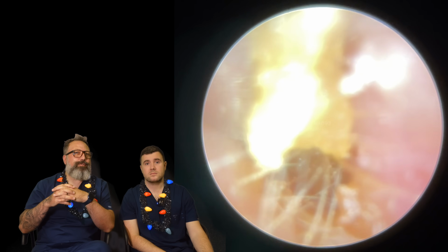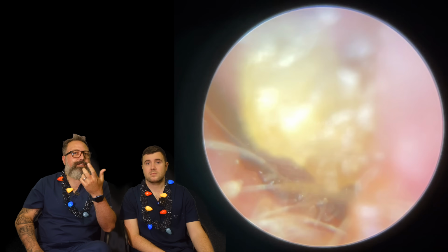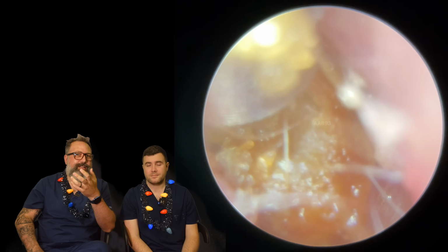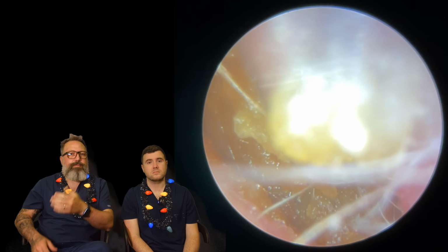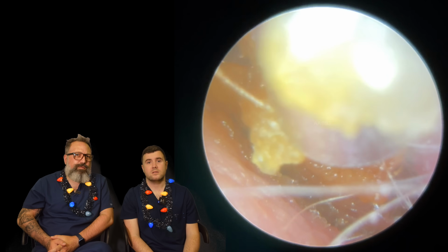So there's no wax. Now, lots of people ask, one of the questions we get whenever we've done a false fundus, do they get wax behind the fundus? Well, the answer to that is no, because it's skin migration beyond that. So it's literally just going to be bits of skin and stuff behind there, so you wouldn't really do anything with it. A lot of patients opt not to do anything with it unless it's causing infections or other problems, but that would have to be a surgical removal. But this is just a little bit of wax on this side.